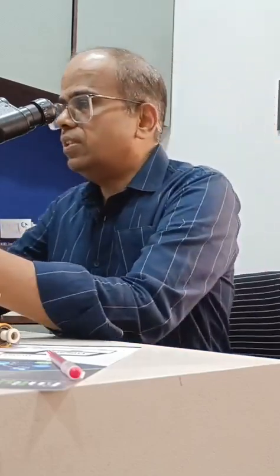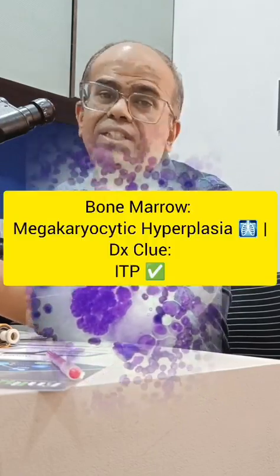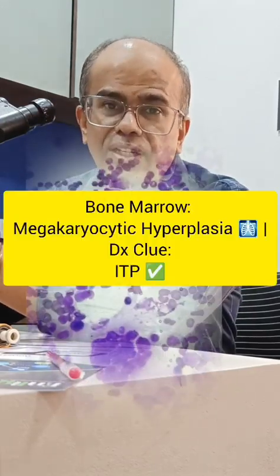Then, let us see what is happening in the bone marrow. If you look at the bone marrow, the particles are very hypercellular. The marrow itself is cellular. It is trilineage hematopoiesis. All the three elements are seen. RBC precursors are functioning normally, WBC precursors are functioning normally, there is maturation, there are no increased blasts, and if you examine the marrow fragments, they are very hypercellular and they are showing lots of megakaryocytes. 4, 5, 6 megakaryocytes per fragment, they are there. So it indicates very florid megakaryocytic hyperplasia.